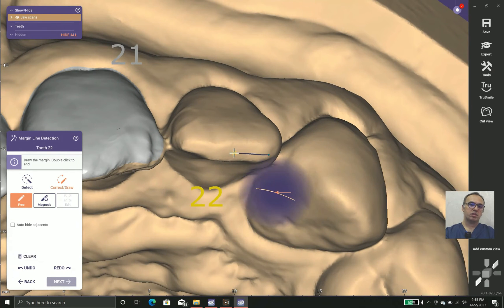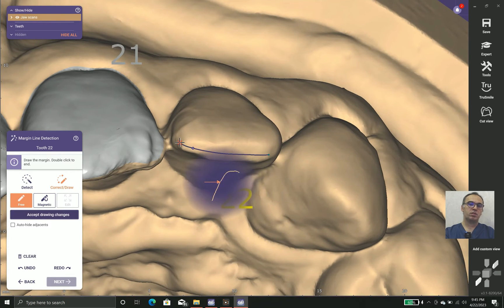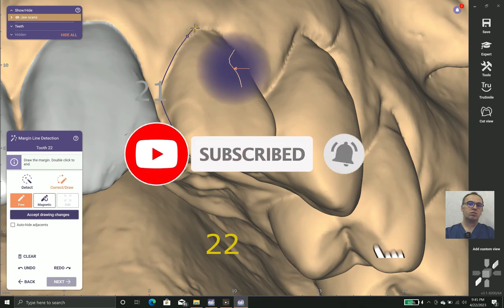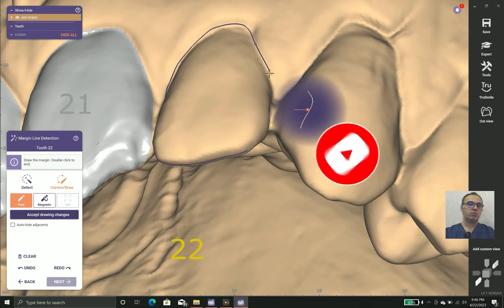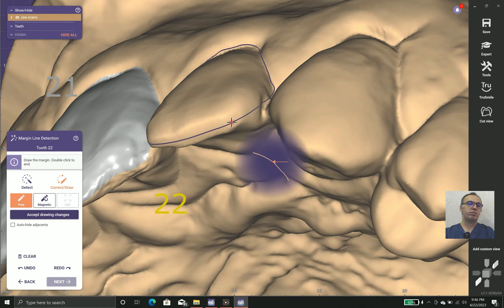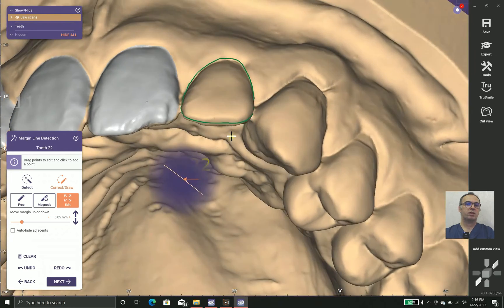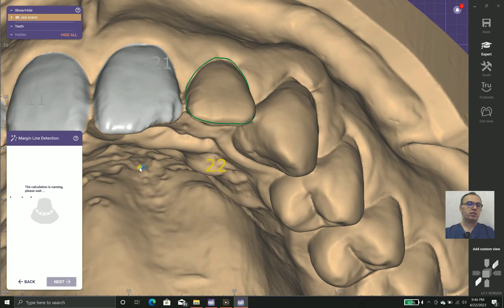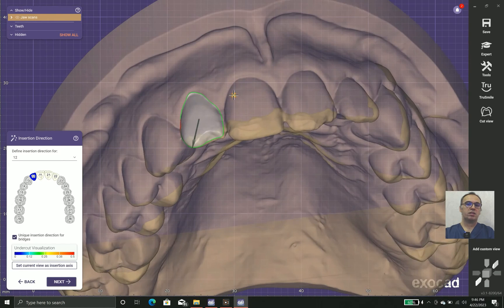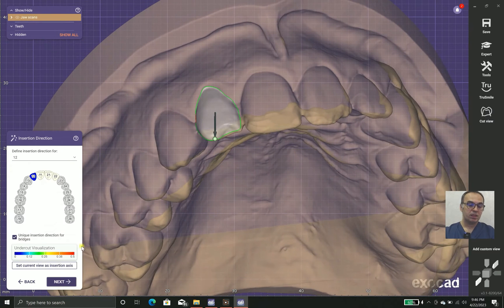Another important point: when placing margins on the incisal edge, don't go too far lingually. Going too far lingually creates a lip on the lingual surface, causing two problems. First, many milling machines can't mill that, which will have a tremendous effect on your final result. Second, it limits your insertion direction.